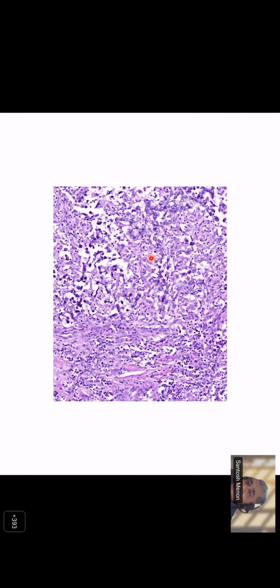Yes, sir. Probably because this has got typical findings of a malignant tumor in the testis in a young patient with septae showing lymphocytes and a prominent nucleus. So this is a germ cell tumor and the classical morphology of a seminoma, although there is some smudginess of the nuclei, which makes you think whether there is embryonal carcinoma or not. But then there are some granulomas.